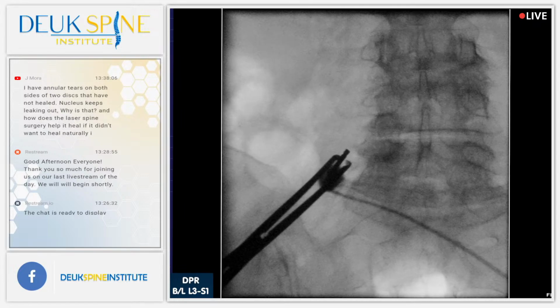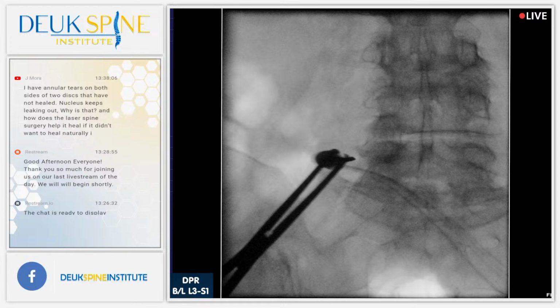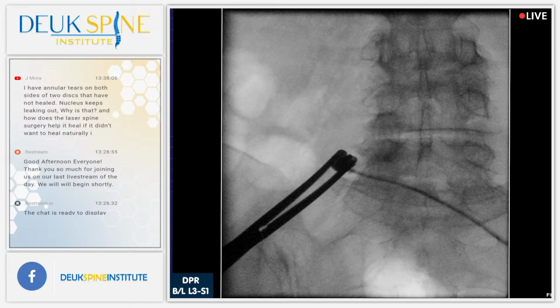And as you can see, if you're watching, it takes more than one burn. And yes, it is a burn. Sorry, but that's exactly what it is. So that's why we talk about it being a burn, because it actually is a burn. You're burning a nerve that actually travels up to the facet joint and transmits pain signals from the facet joint to the brain. And so what pain signals there are is pain signals from arthritis emanating from that joint.